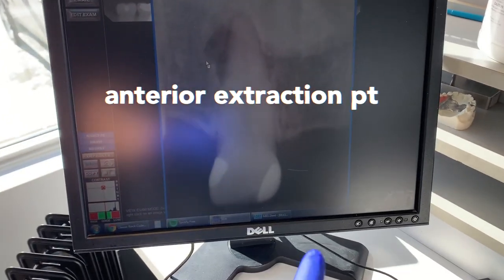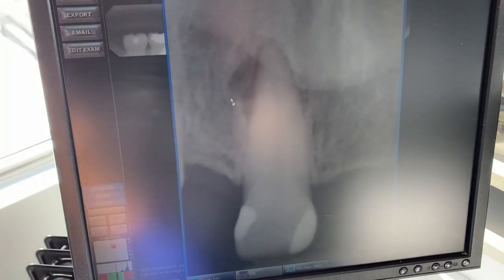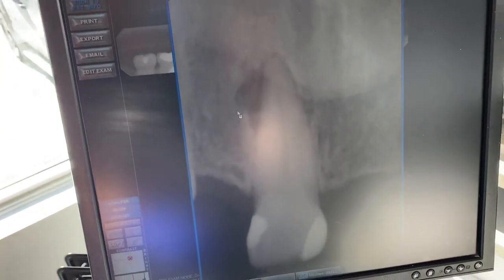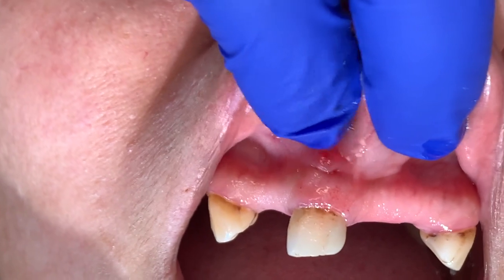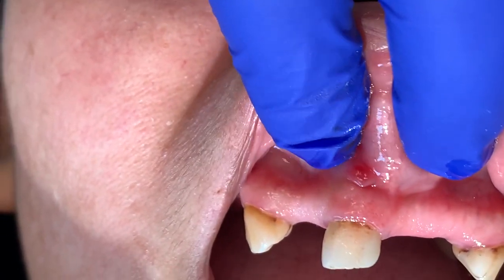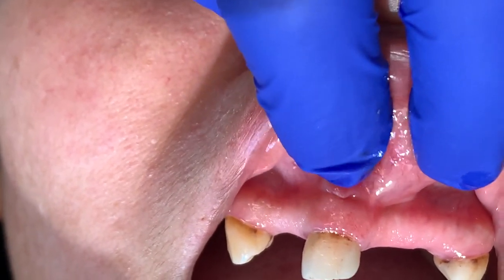So our next patient has presented with a large infection over her front left lateral tooth. She's declined root canal treatment and has decided she'd like to have it removed. This is a common presentation for a tooth that has a dental infection. You can see it almost looks like a pimple above the tooth. This is the infection that's developed, finding its easiest path of escape, which is coming out through the bone and the gum tissue.